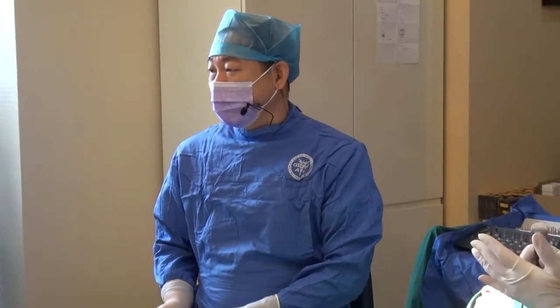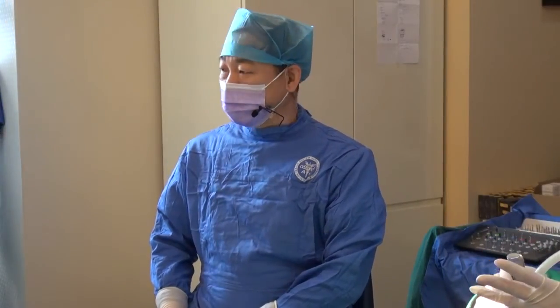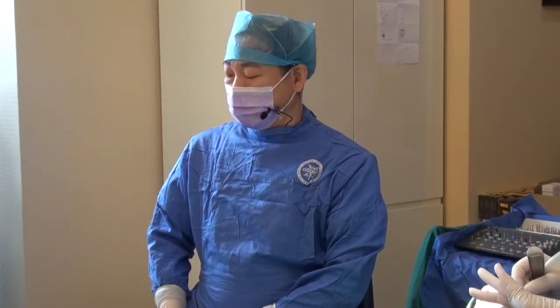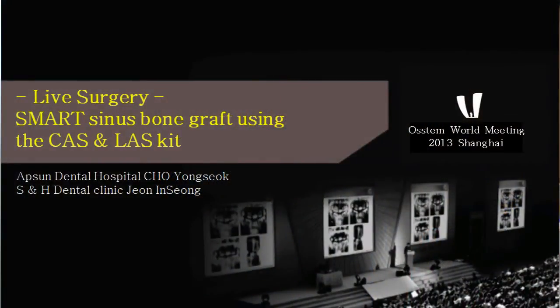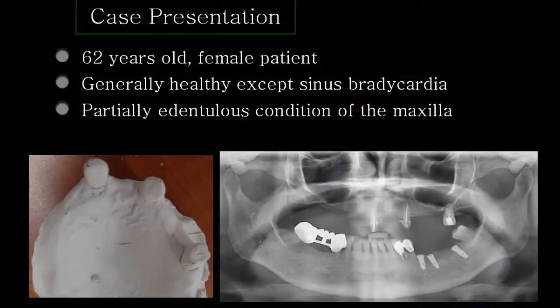It's my great honor to present live surgery in front of distinguished doctors. Today, I want to perform live surgery in a patient who is missing maxillary teeth. I will use the CAS kit and the LAS kit, which are Osstem's nice instruments, to perform a sinus bone graft. Okay, I'll present the case of the live surgery.